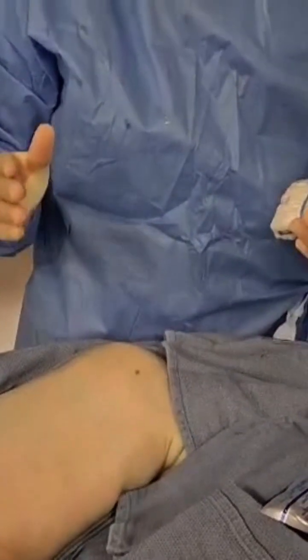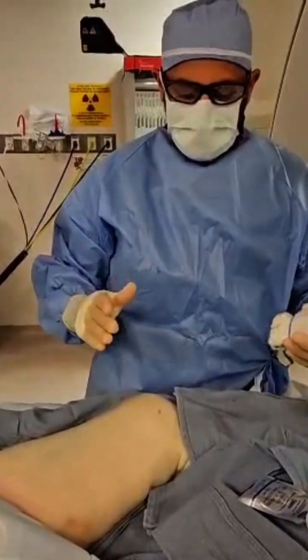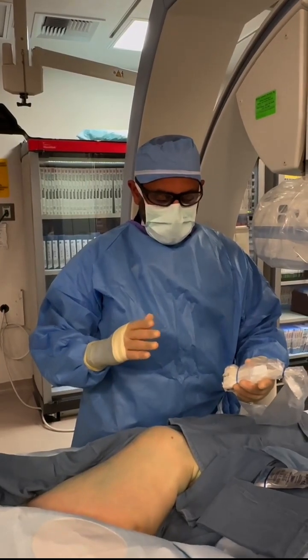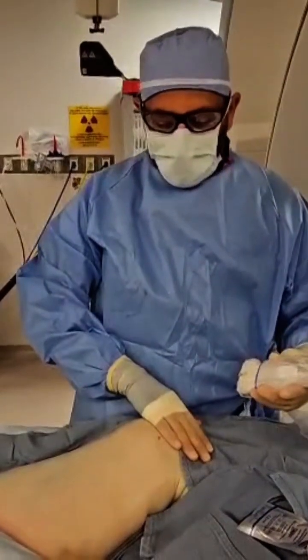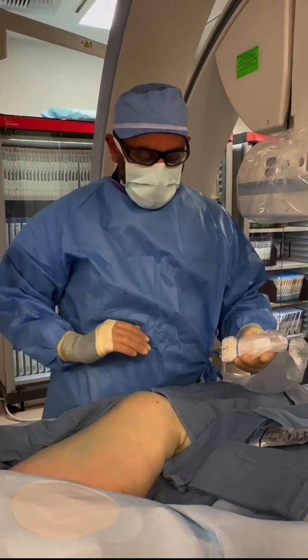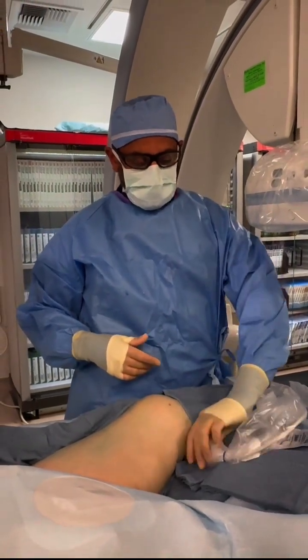Today I'm going to show you how to do a frog leg access of the popliteal vein. This is a trick I use especially for patients who are really obese — it's a little bit of out-of-the-box thinking to access their vein, but it really works well. We keep the patient frog leg. Our patient is under general anesthesia and we put the transducer transverse right into the popliteal fossa.